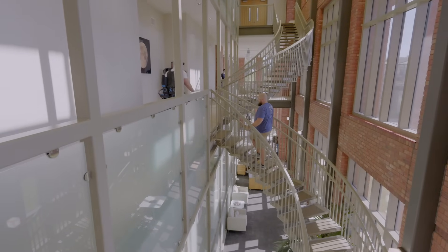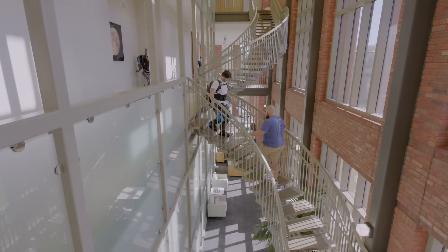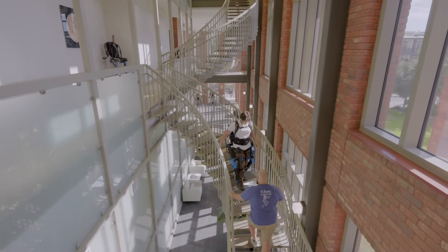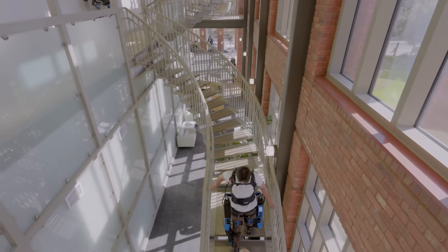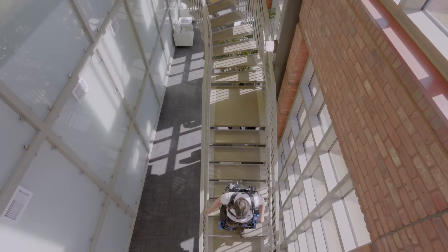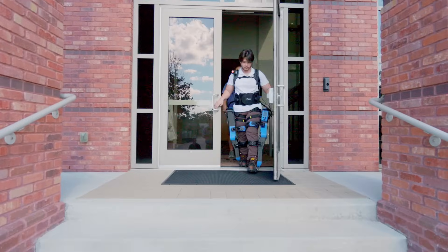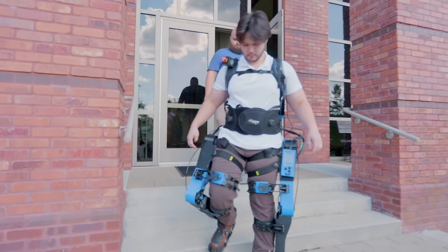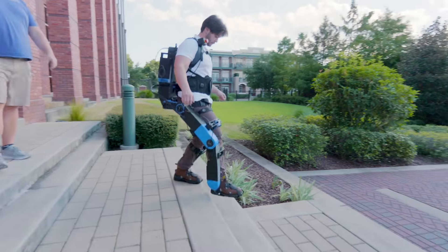This is the first time ever going downstairs on the device. Since it was the first time going downstairs, I was a little nervous, but as I took the first few steps, I realized there was really no need to be worried because the exoskeleton was doing its job and providing support for my legs as I moved down the stairs. I also realized I didn't have any handholds, which was a little scary, but I had a lot of people around me to help, which was really nice.